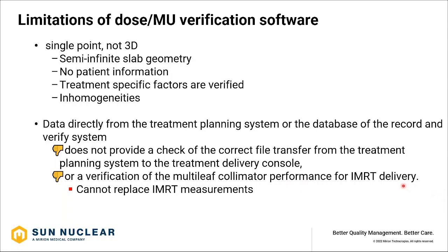So it cannot be used as an alternative method to replace actual IMRT measurements. Therefore, it fails to actually identify any kind of file corruption when you move the file from the treatment planning system to the treatment delivery console.